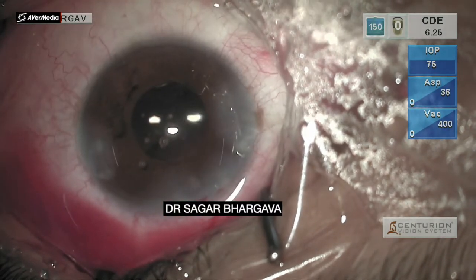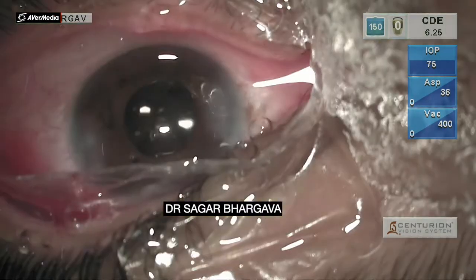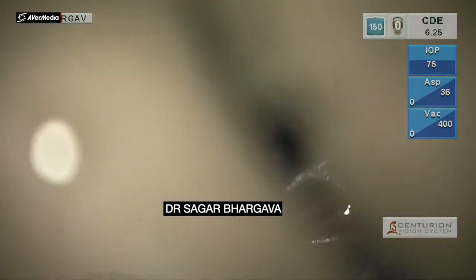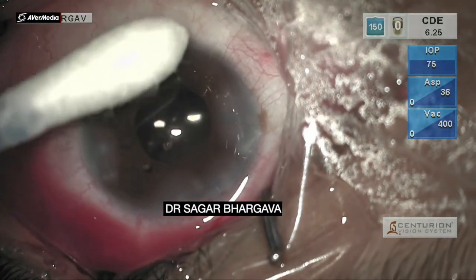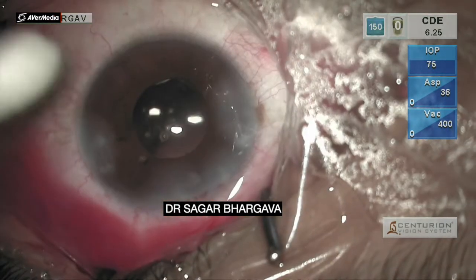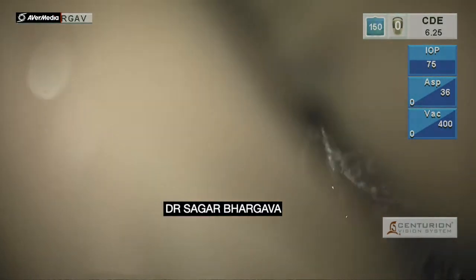This case highlights that one has to be cautious while advising a trifocal IOL in a young patient who has a unilateral cataract. More often than not, they tend to compare their visual quality with the normal eye and are always dissatisfied with the outcome. It is much safer to go for a monofocal IOL in these patients to achieve the best quality of vision possible.